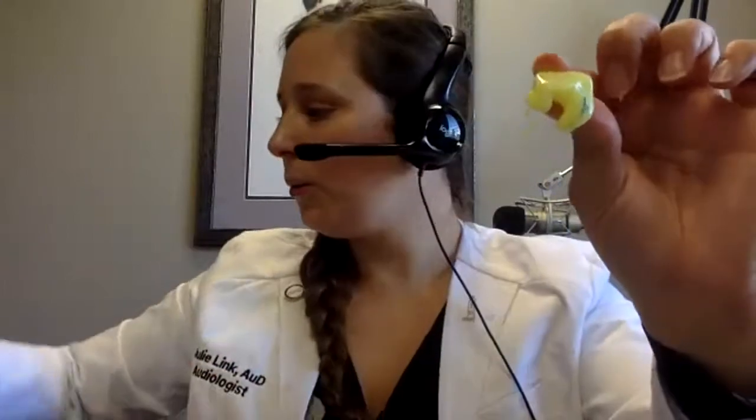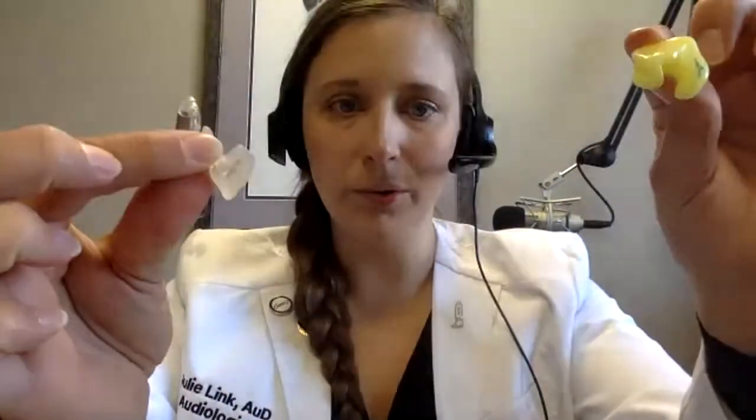It's still under remake warranty. If your earplug or your ear molds stop fitting as well, the size of your ear changes with weight changes.